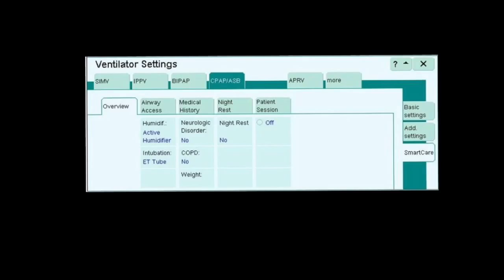Now let's compare that last scenario with SmartCare pressure support. If we were to classify the mode, it'd be pressure control, continuous spontaneous ventilation, and the targeting scheme it'd use is intelligent, and that's why I'm making the small i right there. That's supposed to be an i.